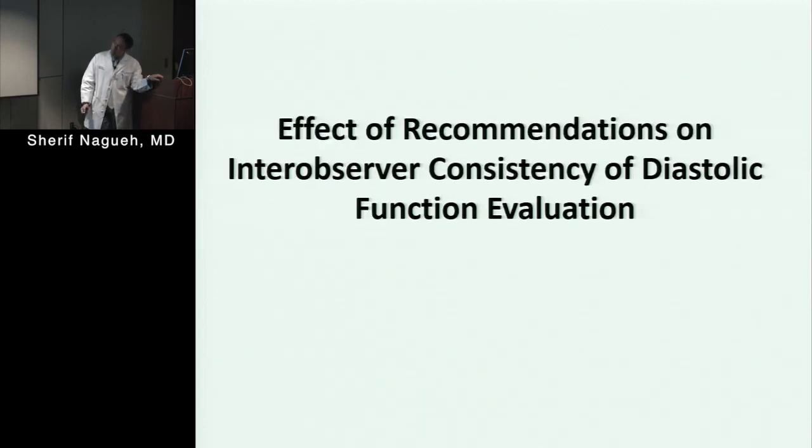Another question to add is the recommendations and inter-observer consistency. The older guidelines were looked at, and there was an expectation that whoever is going to apply them has to put things together. However, some people used them in a way where all variables have to be met before I call something normal or abnormal. And work was published from Tom Marwick in JACC Imaging a number of years ago showing that the inter-observer consistency is better for estimating filling pressures than for grading diastolic dysfunction.